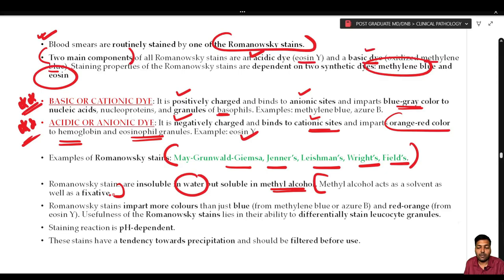As I told you, if you are carrying out staining with a Leishman stain, it contains methyl alcohol, and this methyl alcohol serves both as a solvent for the Leishman as well as a fixative. So usually if you are staining with Leishman stain, routinely you do not require a separate fixative. Routinely it is not carried out in any labs, but in higher labs, in an ideal situation in first world countries, they first carry out fixation and then follow it with Leishman staining. But the Leishman staining also has a fixation part, because of the methyl alcohol that is present.